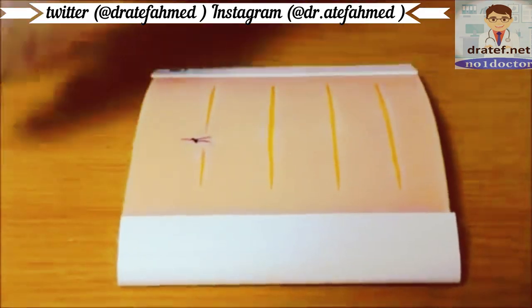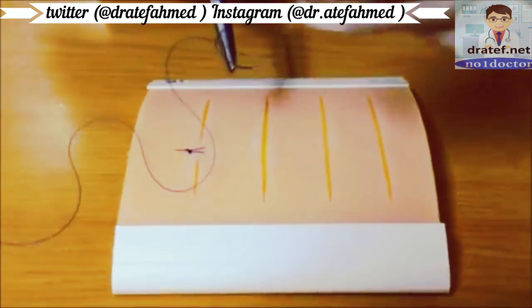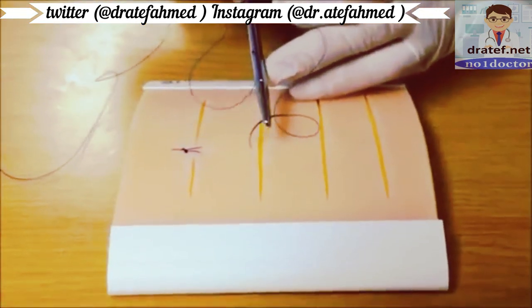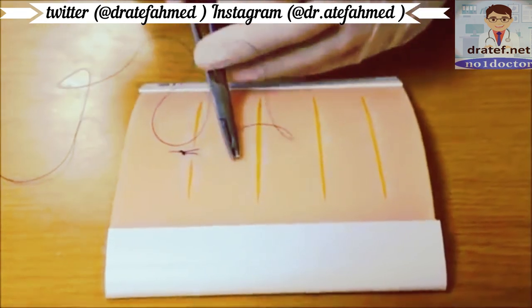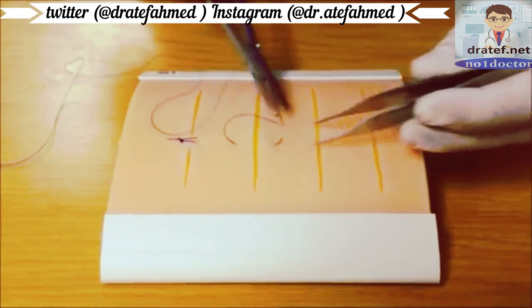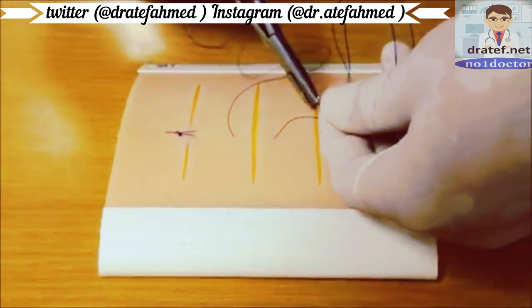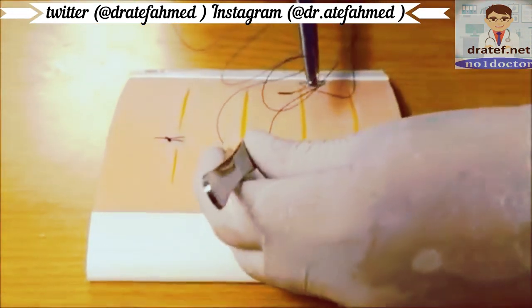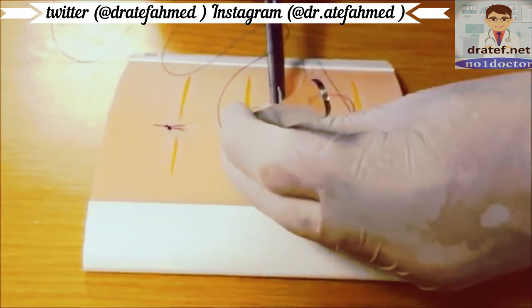Another useful suture is a vertical mattress suture. A vertical mattress suture takes a bit of tissue slightly further and deeper than a simple interrupted suture as an initial throw. Reverse the direction of the needle on your instrument so that you can come back across the wound — go shallow and close to the wound edge, grabbing only a small piece of skin.